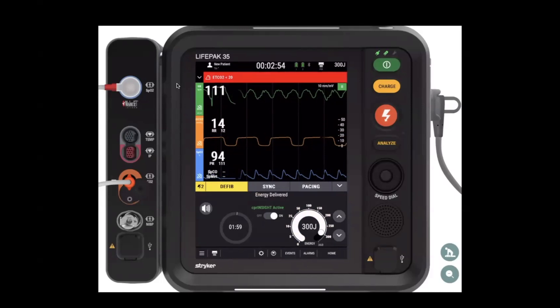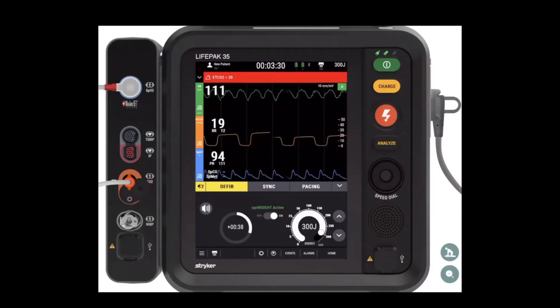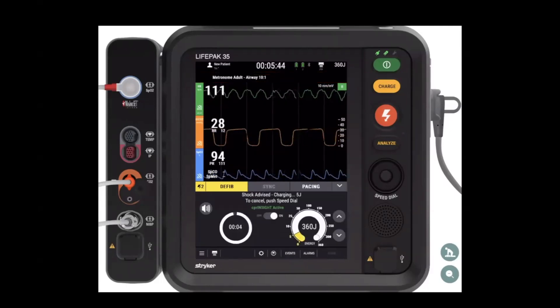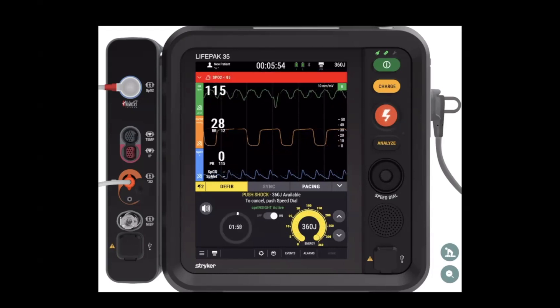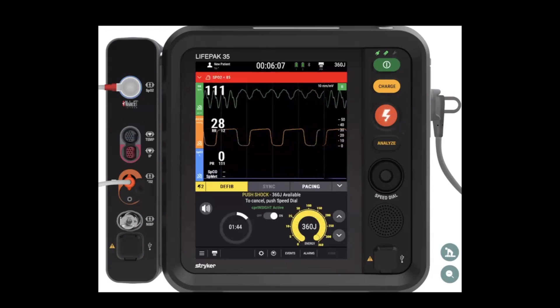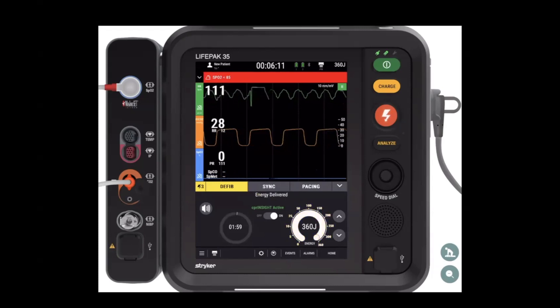So let's take the next patient. Go back — they're in CPR, we do all the things. And what happened to our end tidal over this last two minutes? Our end tidal's climbed. This would be one I'd take a peek at, if you feel better or more comfortable about it. Yep, still in VTAC, no pulse. We don't have any pulsatile flow with our pulse ox, we didn't feel one. Shock, get back on the chest. You can use end tidal as a driver for your comfort as well. If you see the end tidal climbing over time, that would be one I'd take a peek at.